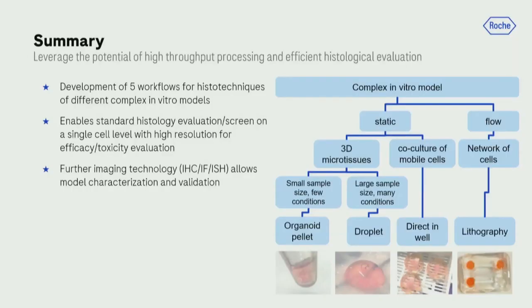So I will bring you back to this schematic. So now we have developed those 5 different histotechnique workflows, and this really enables a standard histological evaluation and screen on a single cell level. With a high resolution, we deal here with 40x images for efficacy or toxicity evaluation. And as I showed you with 3 examples, you can use those for model characterization and validation.